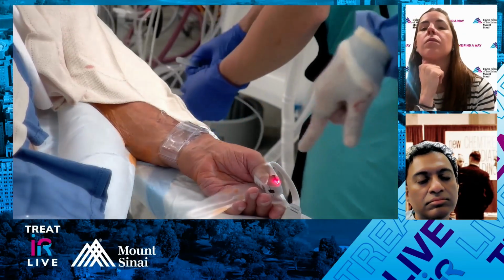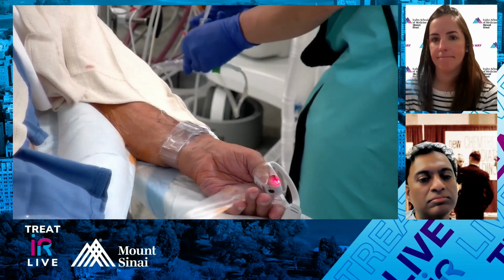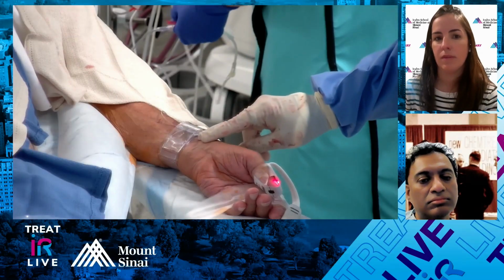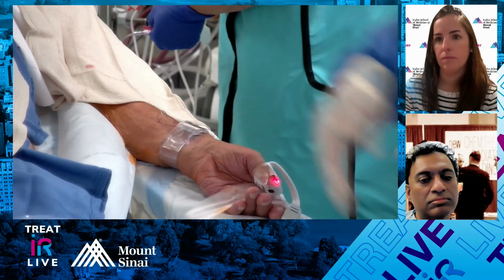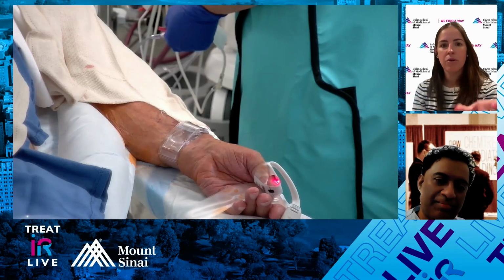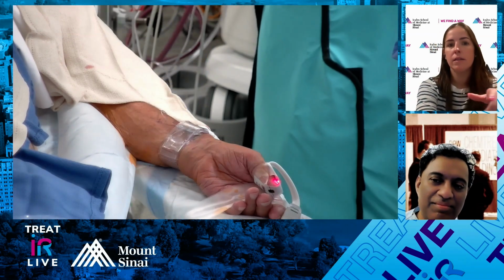The other thing we do is monitor the perfusion of his hand. So we keep our own pulse ox on his left thumb, and there's a good waveform, so we know his hand is well perfused. We do feel a pulse distally, so I'm not really worried about his hand perfusion. That's sort of how we monitor our access. Important point: that's patent hemostasis.